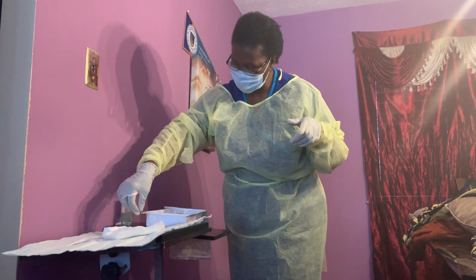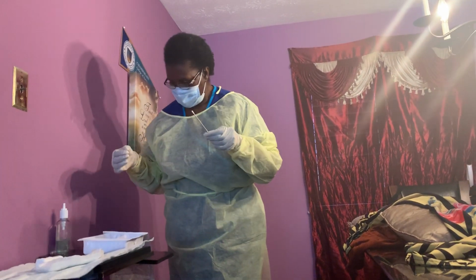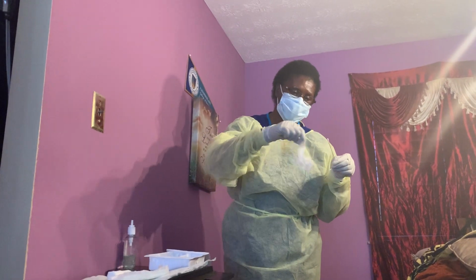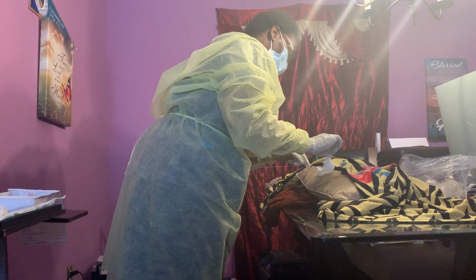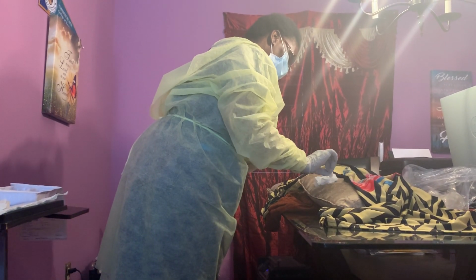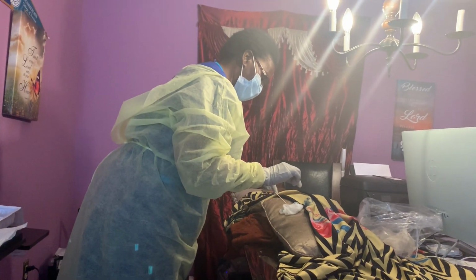So I'm gonna, this is my sterile hand, I'm gonna pick it up from the sterile field, pass it to my clean hand from here, and then I'll use my sterile hand to pick up the gauze. I'm gonna make sure I open it, and then I'm gonna pack. So make sure everything is packed inside the wound and not outside, it's not touching the wound. So safe, just assume everything inside is not touching the wound, the skin.